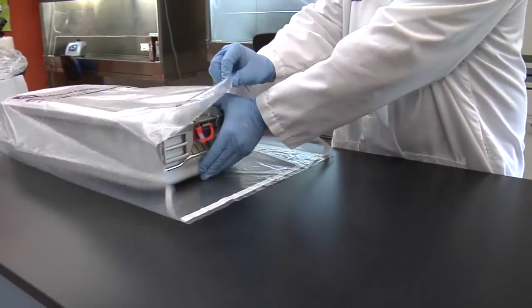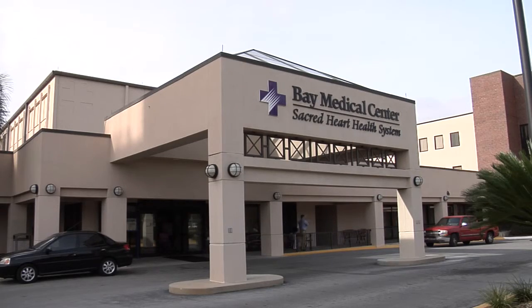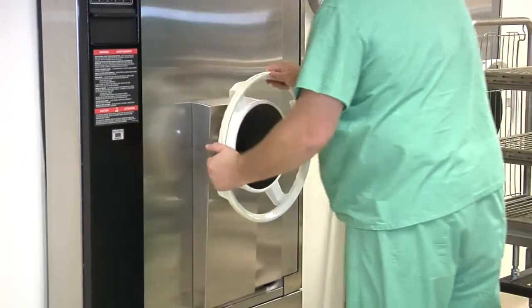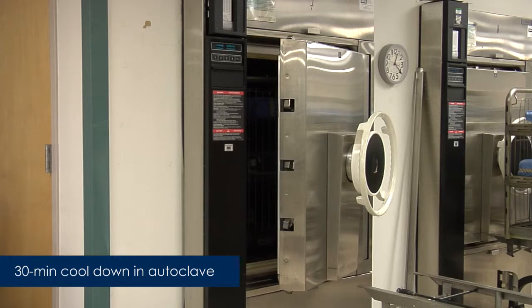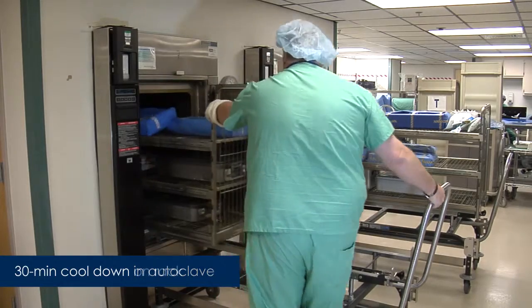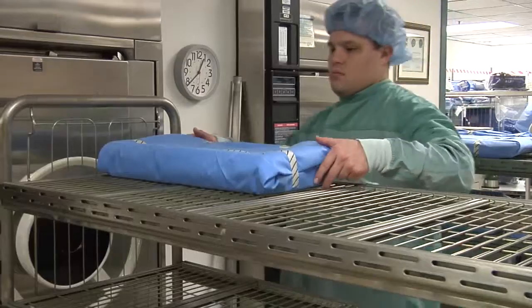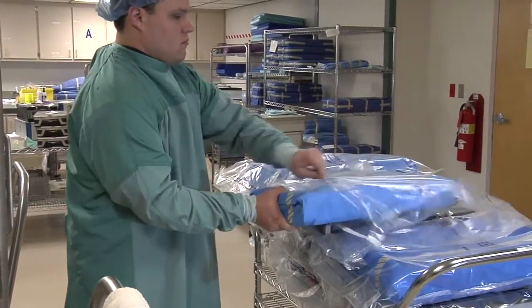All test packages were placed in sterility maintenance covers and transported to Bay Medical Center in Panama City, Florida. All packages were sterilized using a standard steam sterilization cycle — a four-minute pre-vacuum cycle at 270 degrees Fahrenheit — followed by a 30-minute drying period. Once the cycle was complete, the autoclave door was cracked and packages were allowed to cool down for 30 minutes while still in the autoclave, then moved to a cooling rack for an additional 30-minute cool-down period. Once cooled to the touch, they were placed in new sterility maintenance covers and transported back to the ARA facility.